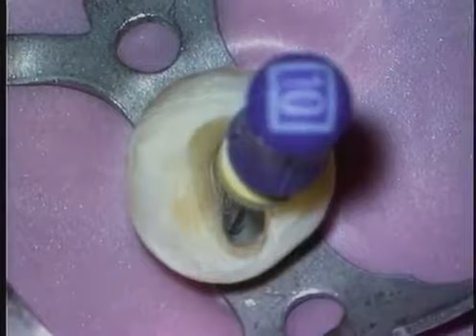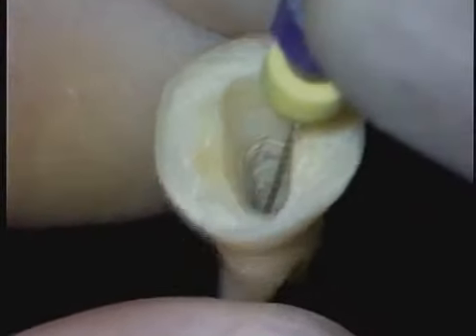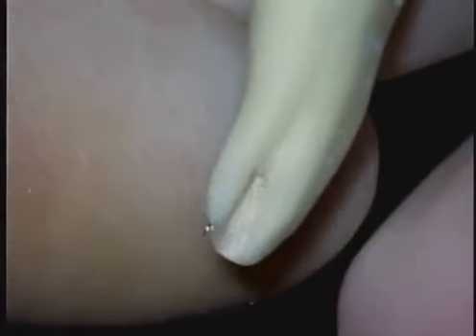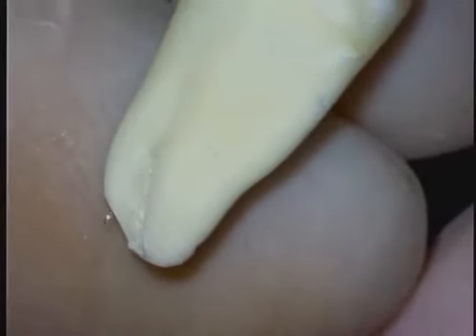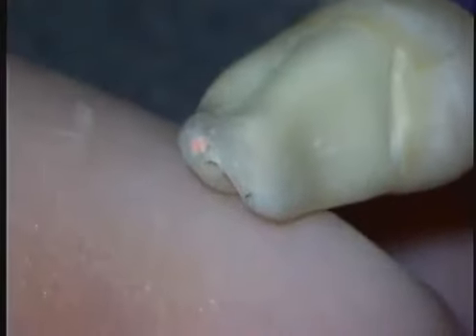Now working the instruments to length can be pretty revealing, because looking at the extracted tooth you can begin to see the broad root, you can see that it's a fused root, the apical third has a cul-de-sac furcation, and the system that we just negotiated has its own separate apical portals of exit. You can see the gutta percha on the more facial aspect.